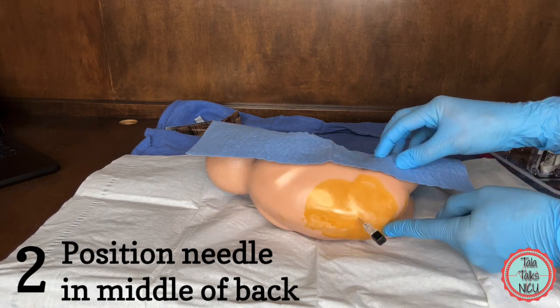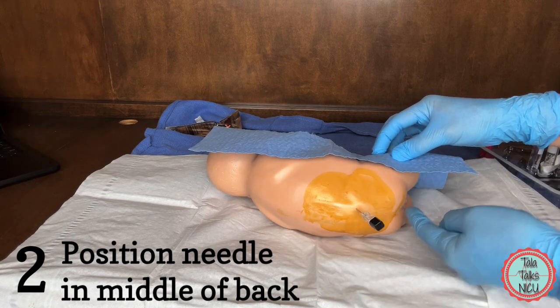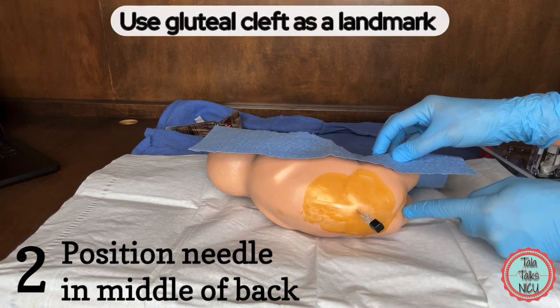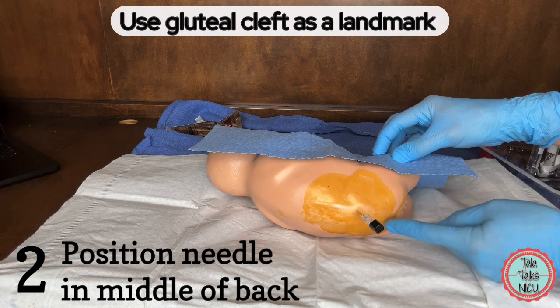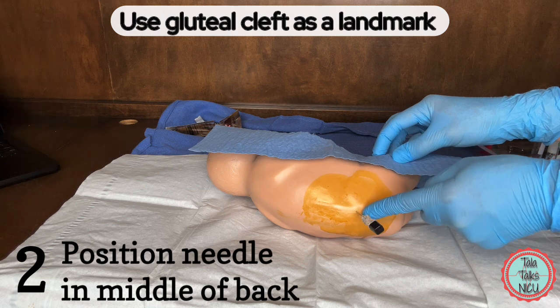Check that the baby is not rotated and look where you've stuck. Does it align with the middle of the back? I like to use the gluteal cleft as a landmark as well. And you can see quite clearly here that this needle is too lateral.